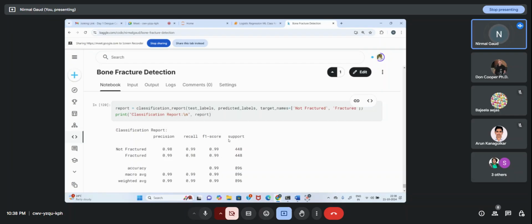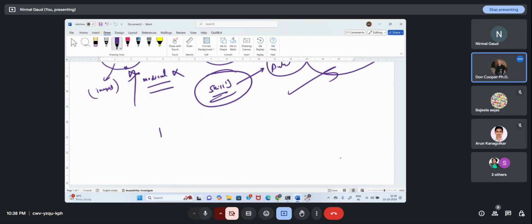The point with Xception, I told you, pre-trained models do work on color. I see. Yes, sir. Pre-trained models, they do work upon color. So ultimately, I need to convert my grayscale images into color. Then only, sir, I can utilize this pre-trained model. That's what I have seen in the pre-trained models. Because pre-trained models are trained on ImageNet, and ImageNet, sir, has many classes, and obviously we are not taking grayscale images for many classes. Obviously, we have to take the color images.